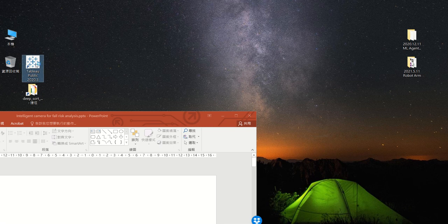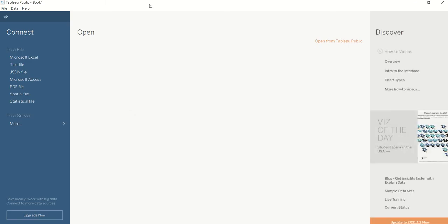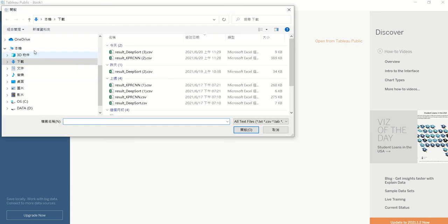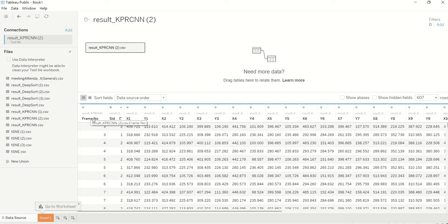Before we do quantitative analysis, I always recommend to visualize it. I recommend using Tableau Public, which is free and very easy to use. Because our data is in CSV, we just choose text file and download. For example, here you can see Tableau imports the CSV file, the KeypointsRCNN results: frame number, subject ID, x1, and so on.